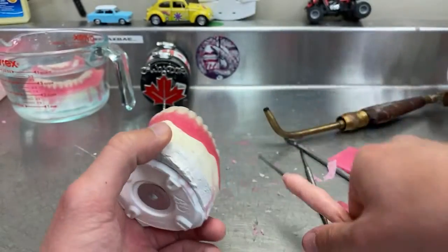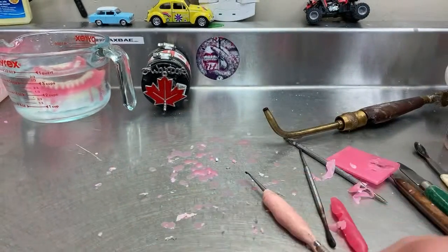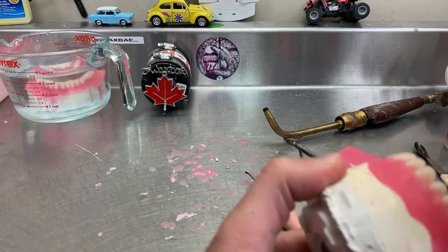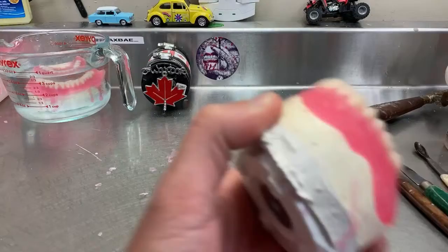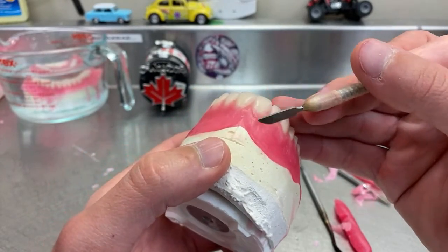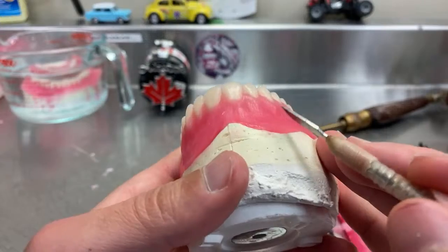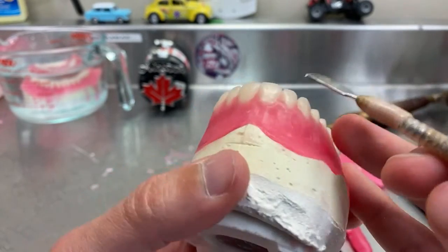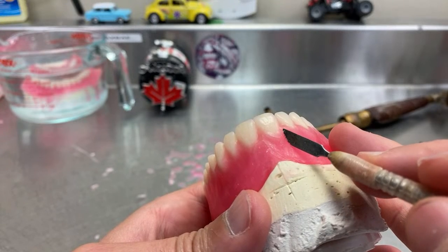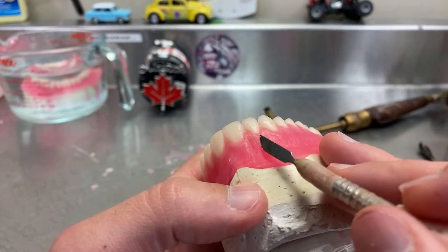So here, what I'm going to show you, let me just clean that up. What I'm trying to get is that little root, giving you that feeling that it's actually under something. It's not sticking out. It's not outside of it. So you see, it comes like that, and then it tapers off. It's more obvious here, and then less here. Same for this one here, which I don't like right now because it looks like the root is showing.